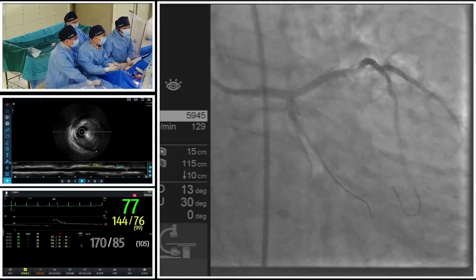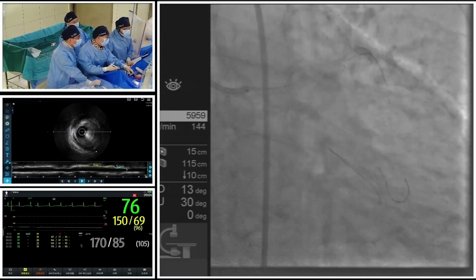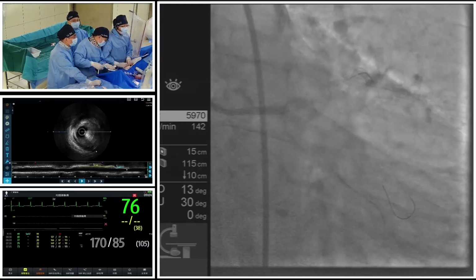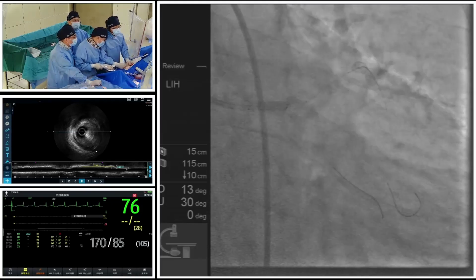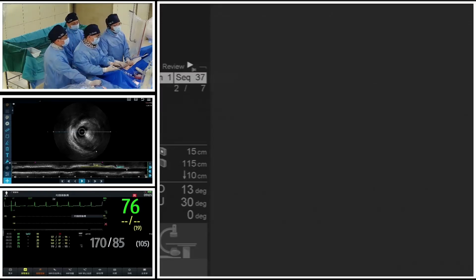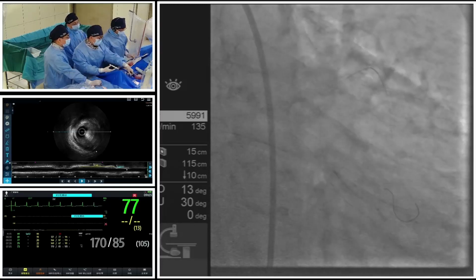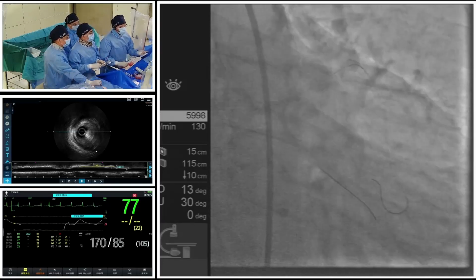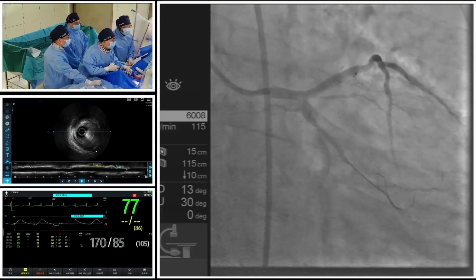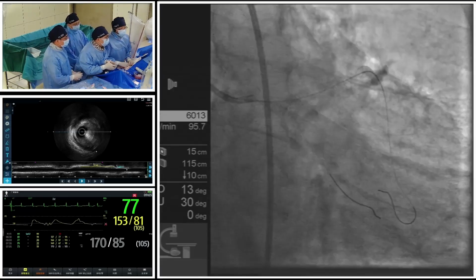Someone worries about the side branch loss of the calcified plaque, because we see a lot of diagonal and, for example, OM branch loss in the calcified plaque. The risk is 6 to 15% bifurcation loss during the calcified plaque. However, with the help of rotablation and other debulking techniques to reduce the plaque burden, we also try to maintain the side branches.